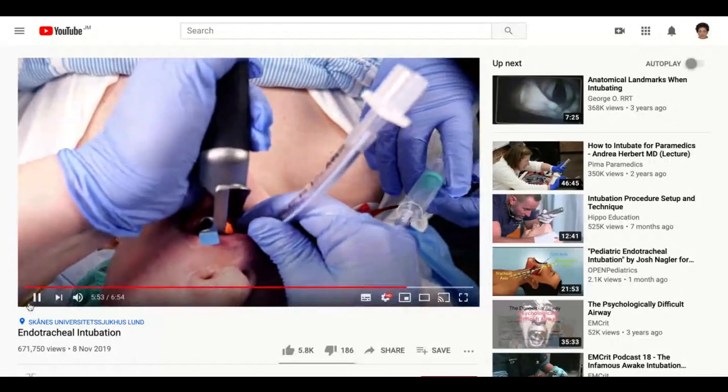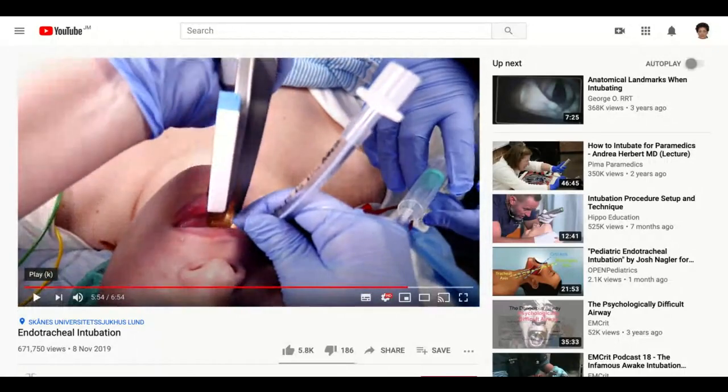Now, has she put it in too far or not? Is it too far in or not? Too far, correct. She did not need to, and you see, the thing about this is when you're using a laryngoscope like that, where the screen is up and everybody can see, I immediately know she's in too far. Once that first line disappears, the cord just needs to rest between the two. Definitely, you should stop at the top one.